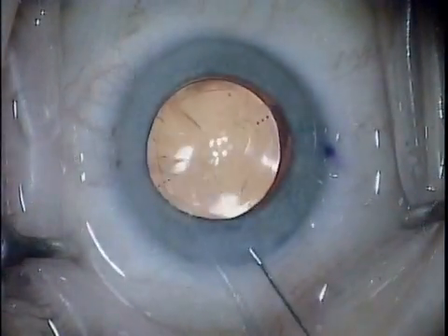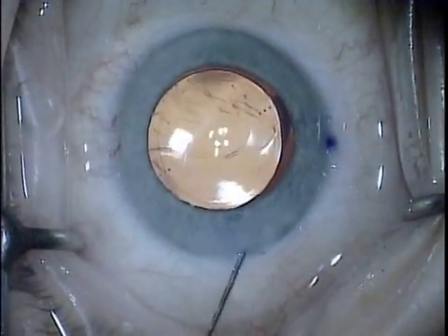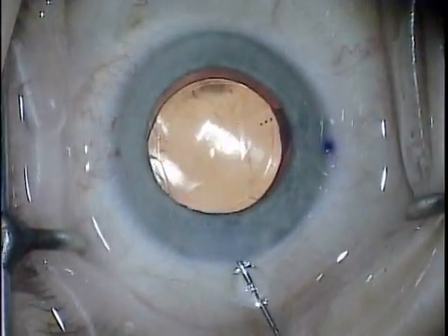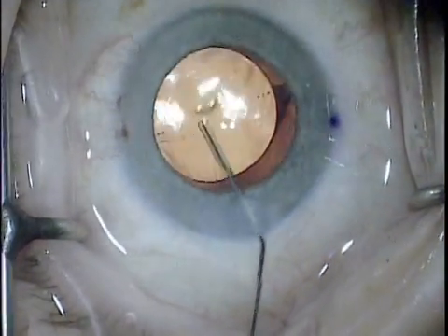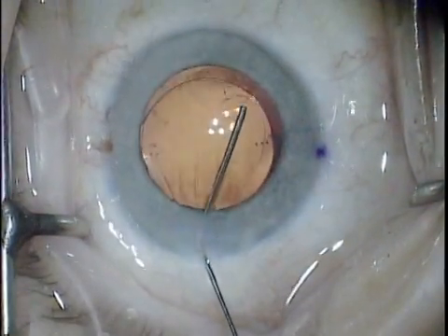The lens is injected into the capsule and is oriented 10 or 15 degrees short of the desired axis. After the viscoelastic is removed, it is rotated into the correct alignment with the dots on the lens directly under the axis.